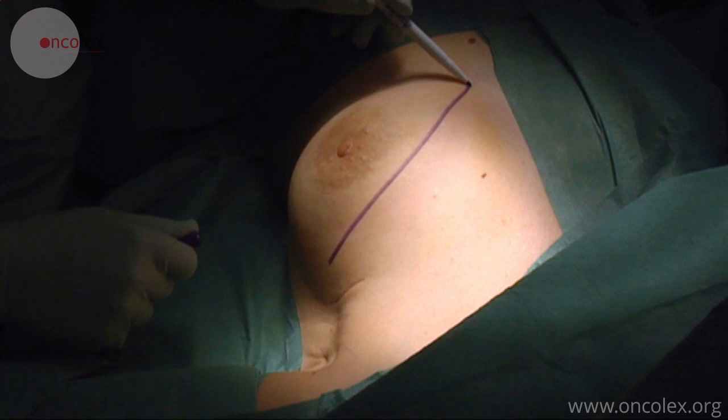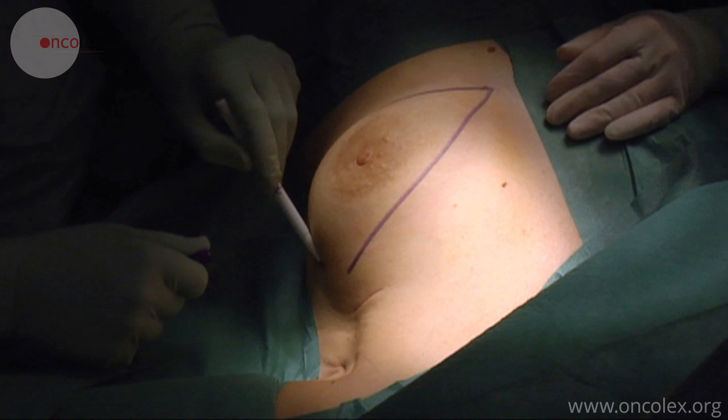This is a video of a left-sided mastectomy on a patient with breast cancer. An ellipse-shaped incision is made on both sides of the areola.